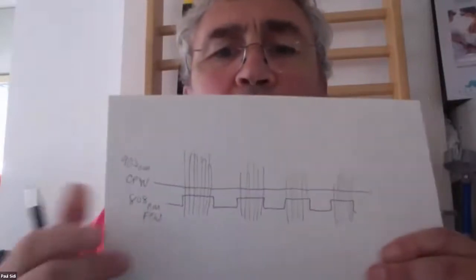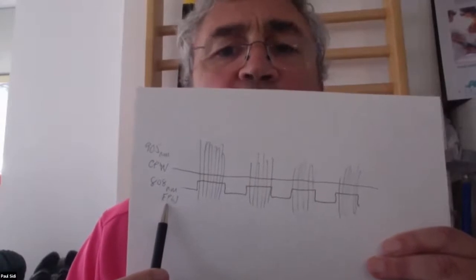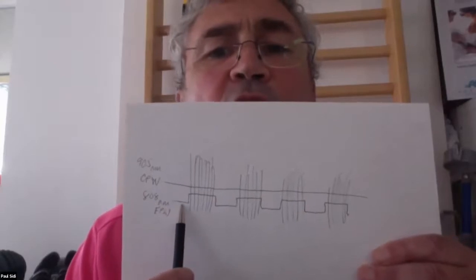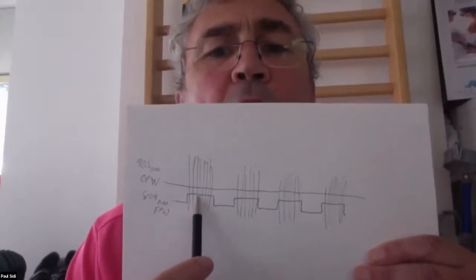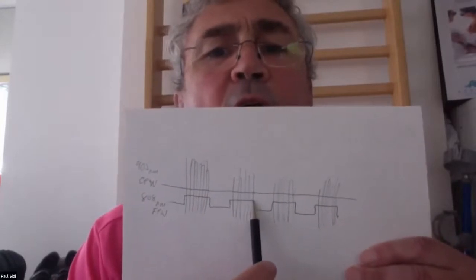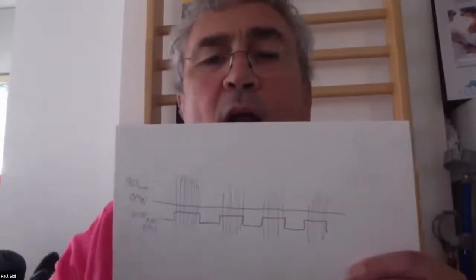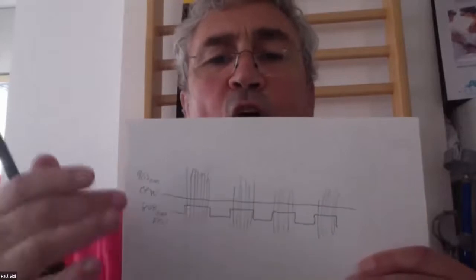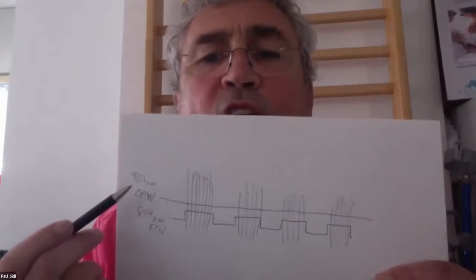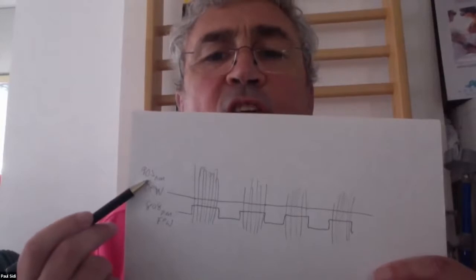Then if you look here, what's happening on the 808 nanometers, on the frequency pulse wave, is what it says, it's frequency. So it comes on, goes off, and it's back on, and it goes off, and so on, depending on what frequency was set. It can be higher, lower, whatever. But there is an element where it's off and it's on. What's happening is, it's all synchronized. Once you got this, you got the 905 nanometers at 25 watts. This is 1.1 watts. This is 25 watts.